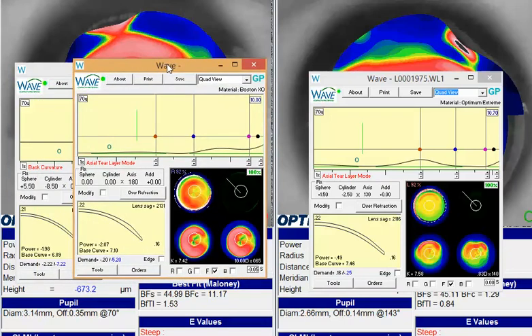Keep in mind that, as you probably already are aware with these highly irregular corneas, the rules tend to go out the window, and quite often you need to use a lot of empirical fitting based on some of your clinical impressions, but I think those design adjustments should help you. Well, good luck with that.